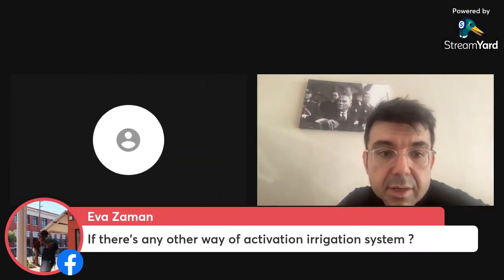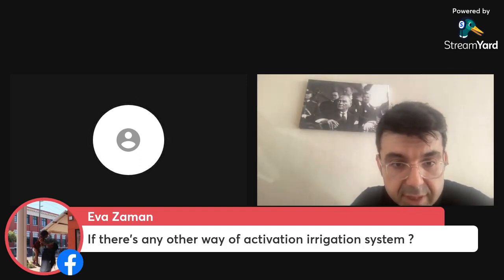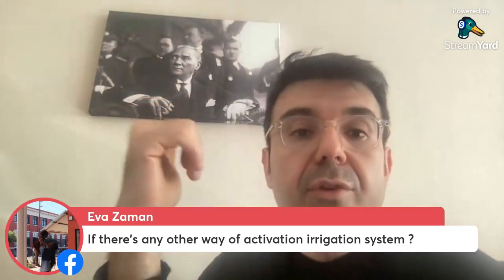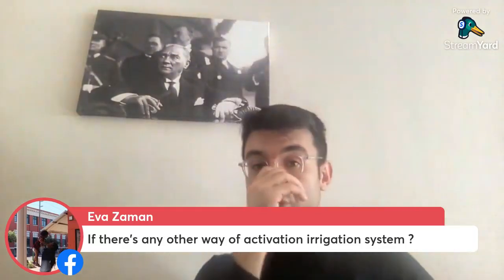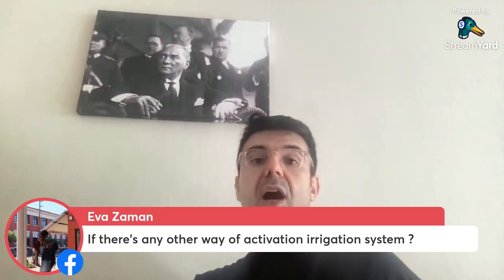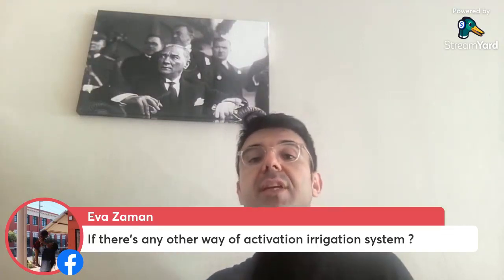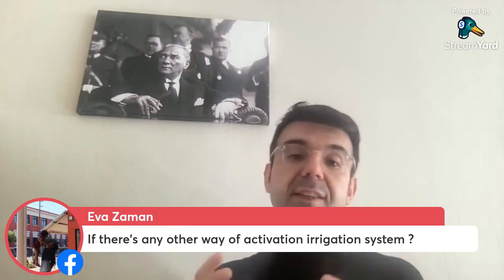Is there any other way of activation of the irrigation system? Dear doctor, as I told you, we are using the latest technology for irrigation activation systems. So I always advise you to use ultrasonic irrigation and sonic irrigation systems, because our aim is to get the power of multisonic activation like GentleWave. And you can obtain this power by using ultrasonic activation and sonic activation. And you should know how to use them efficiently in the root canal.